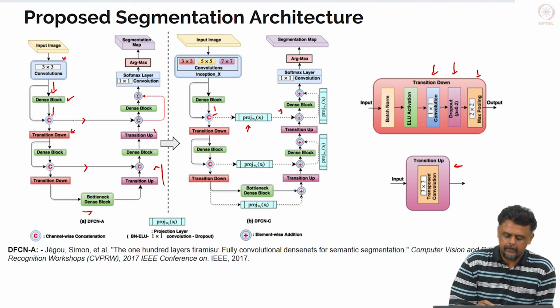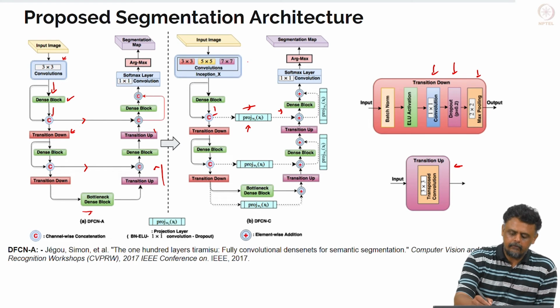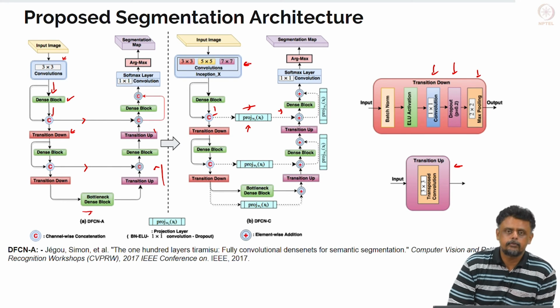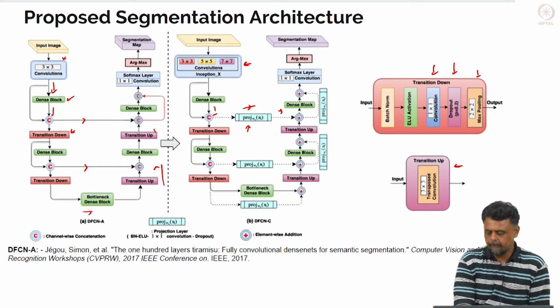There is a direct concatenation, here we project and then we add. We also have an inception module at the beginning to consider different receptive field sizes and different resolutions.